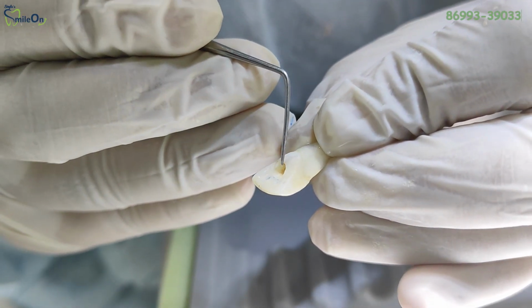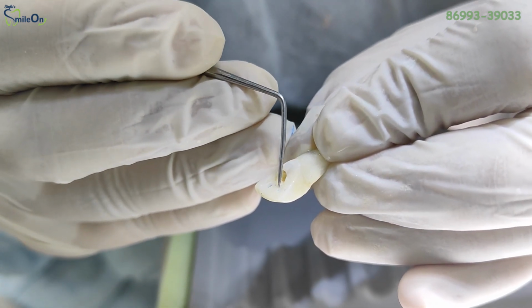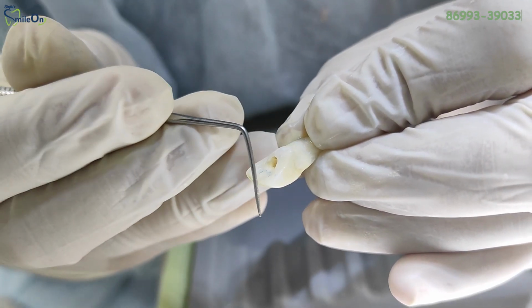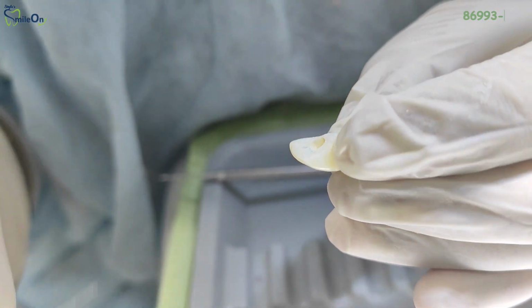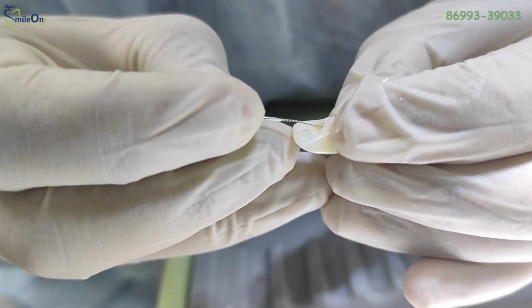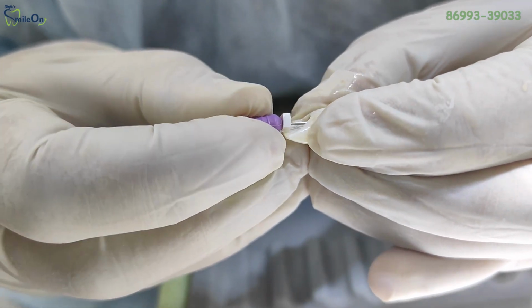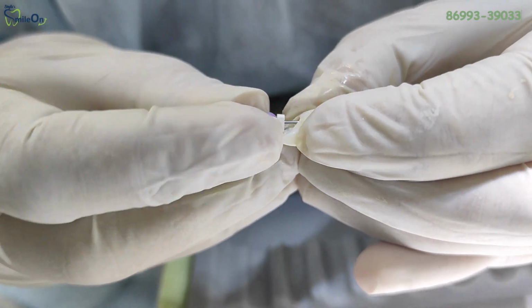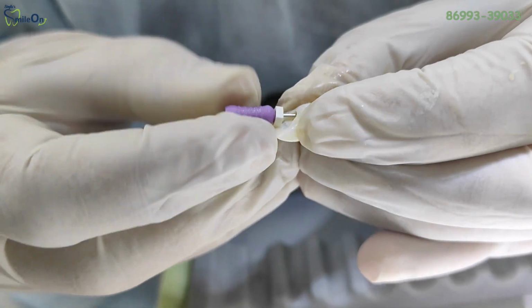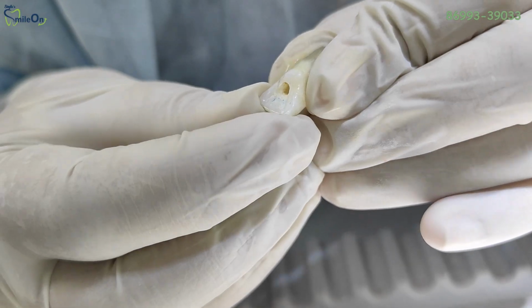Now you can completely see the triangular shape access preparation. The tip is towards the cingulum, however the base is towards the incisal edge of the crown. Now I am inserting a 10K file to check the access. This is my primary file which I am using to confirm my access and to remove the pulp. So this is our access preparation for the central incisor.